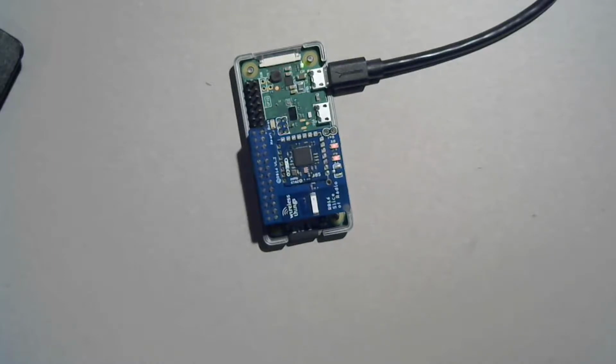But at a higher level, what's going on is we're getting a CGM page of data, which is a continuous glucose monitor page of data. That page is 1,024 bytes. It needs to be decoded. Elixir is great for that. But really all the pump is really responsible for is making sure that we fetch the data that we're looking for. We assemble all the packets in the right order. The CRC checks out, and we go on from there.